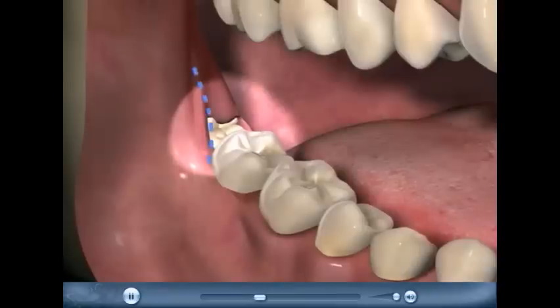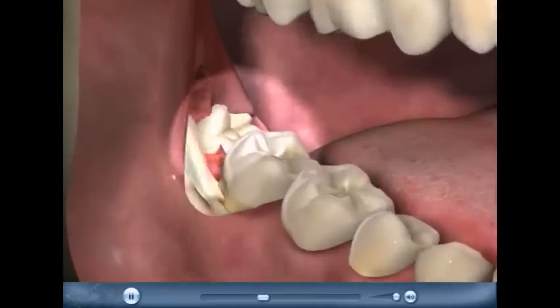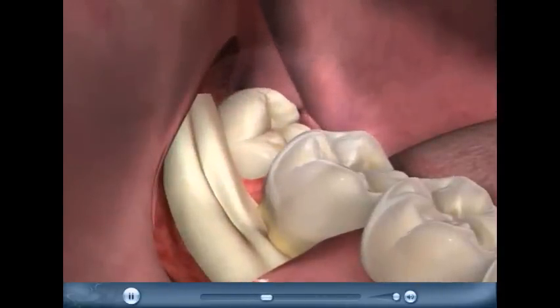A small incision will allow the gums to be lifted back so the misfit tooth is brought into view. If it's still hiding under bone, the surgeon will uncover it some more.